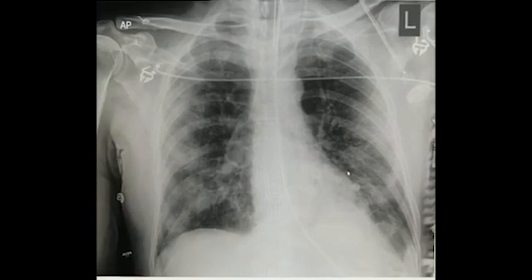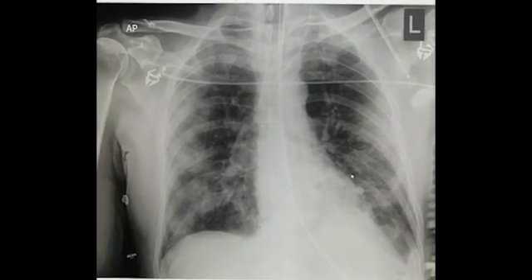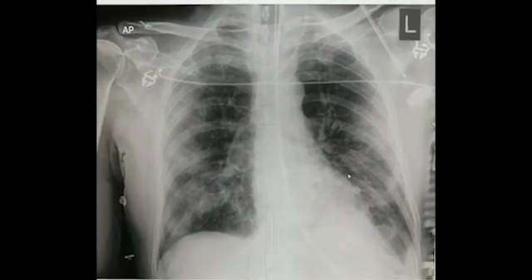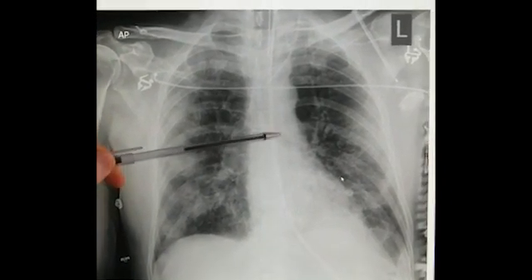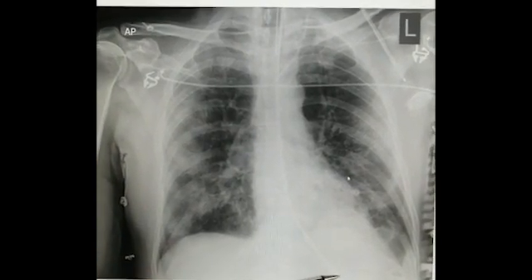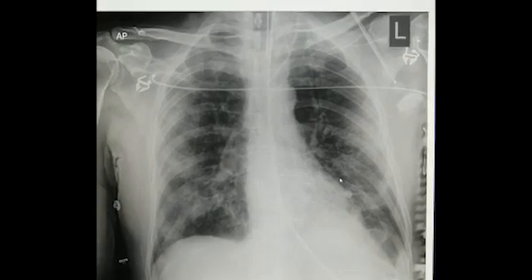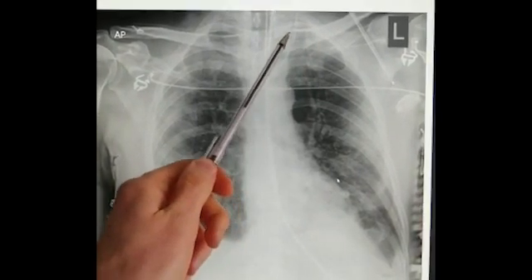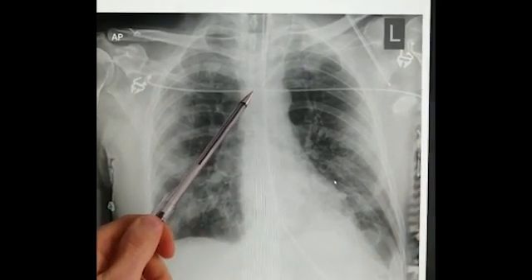A lot of these patients are ending up on ITU, and if you are looking at radiographs from ITU you need to be thinking about lines and drains. Here we've got a case with an NG tube, which you can see missing the bronchi on either side, heading straight down the midline below the diaphragm where it turns left. A lot of these patients have central lines — they may be in the right or left jugular. Here we've got a left jugular CVC line just heading into the SVC.